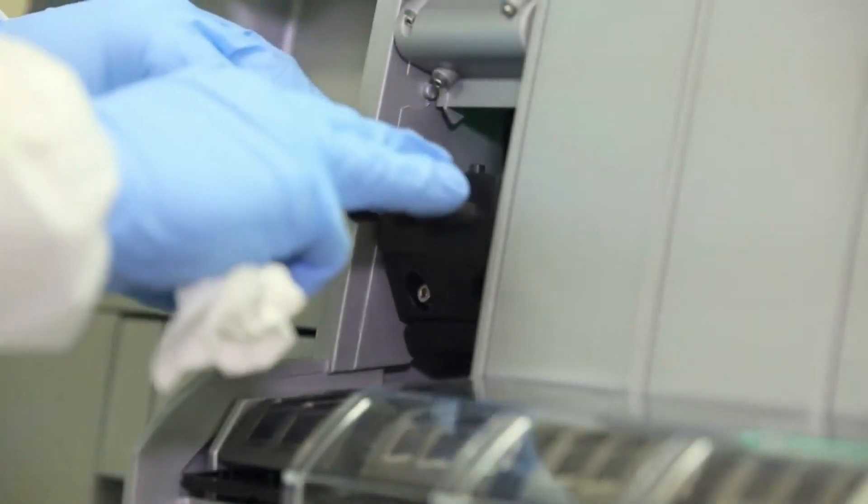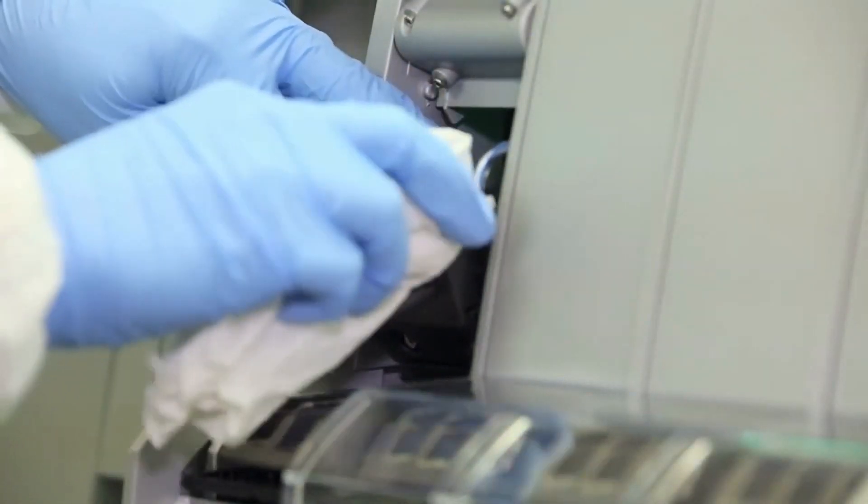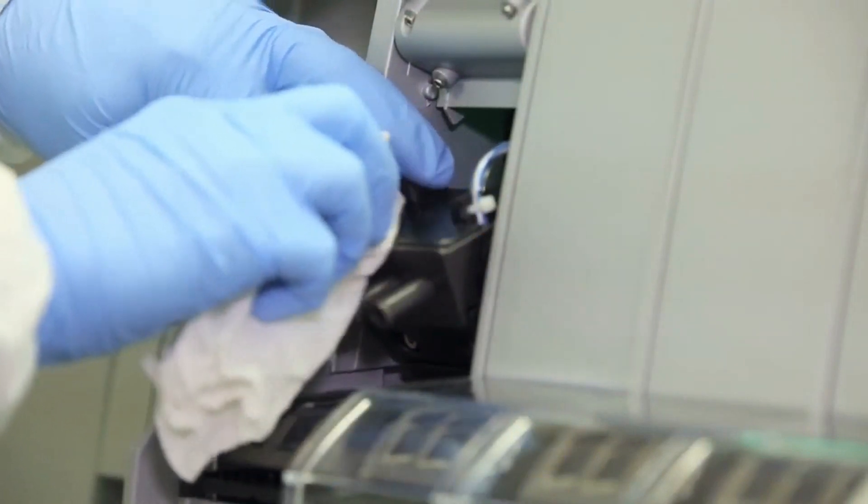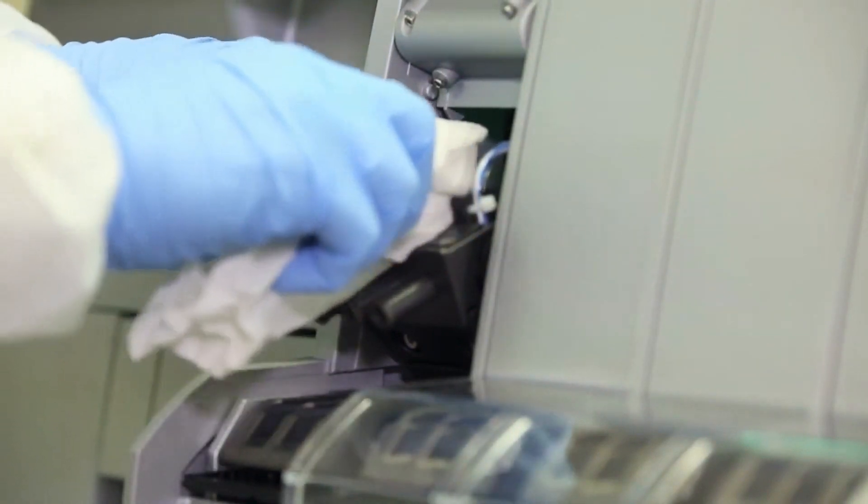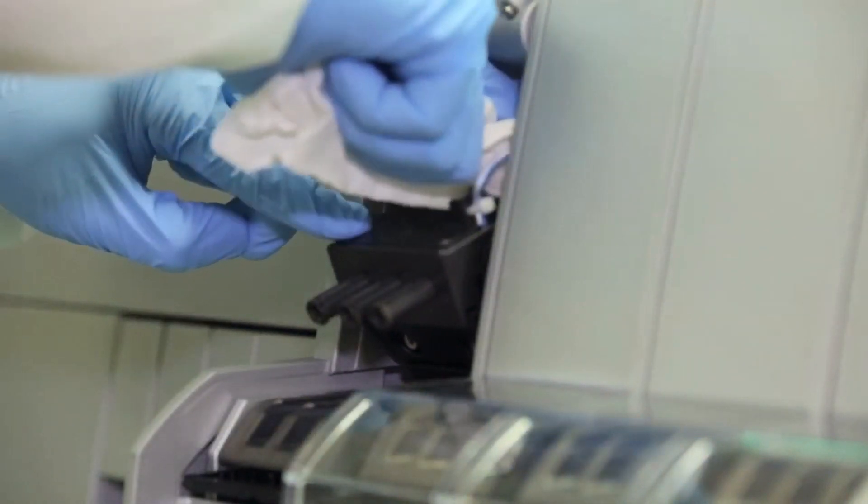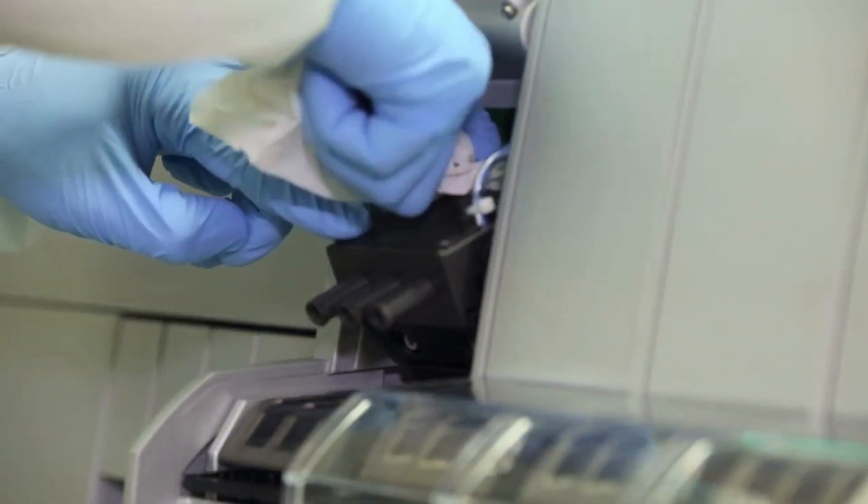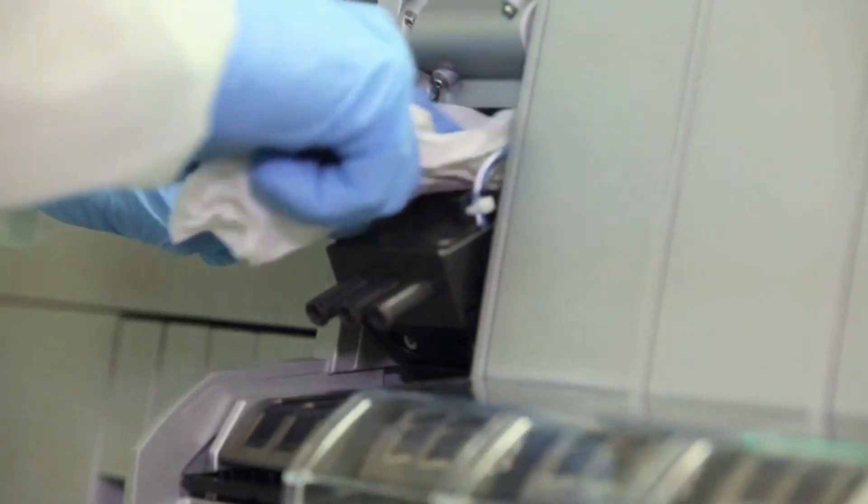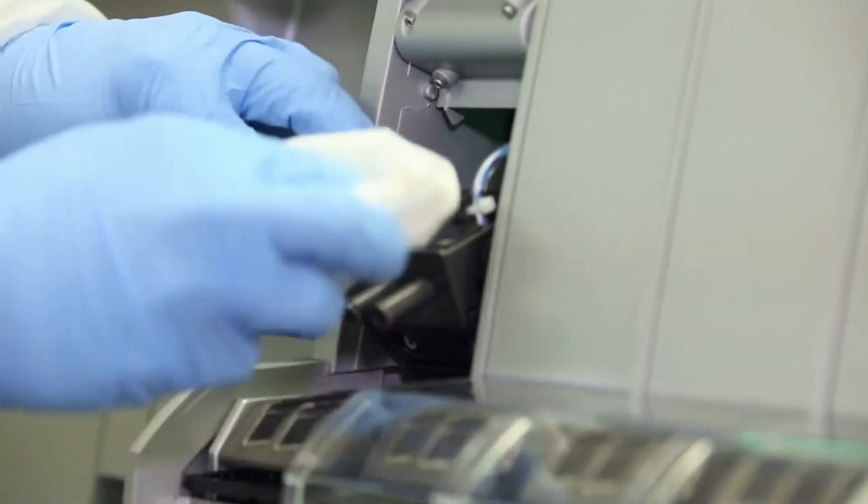Flip the spur block towards you and hold it in this position so that you can easily access all the surfaces of the block. Clean all surfaces of the spur block with a decontamination wipe.